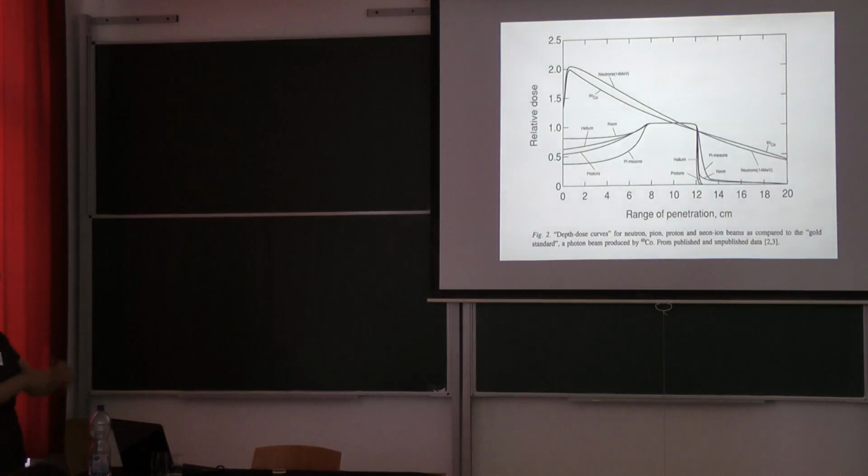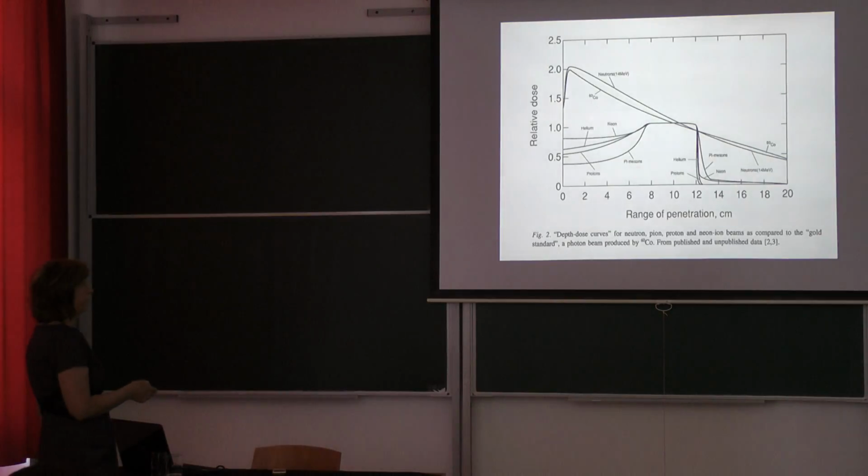And this Bragg peak can be enlarged, but at the price of enlarging the entrance dose as well. But if you compare it to a cobalt or an X-ray or a neutron dose depth curve, it is still better, still favorable from the point of view of tumor irradiation. Imagine that with a low number of beams the tumor is positioned over there, then you can have a very nice dose on the tumor and less dose prior to it in the neighborhood.